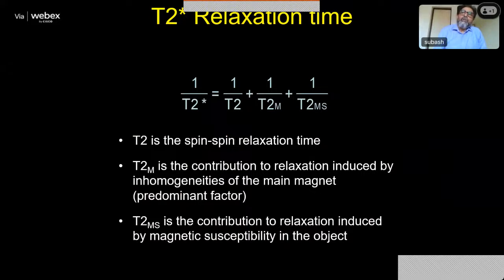They will show up only after 6-7 hours of the stroke. But diffusion, if you study the diffusion weighted image, it will show you within a few minutes of onset. So you need to take help from other aspects also, right? Yeah. Depending on what you want to see, you have to utilize all parameters of contrast.